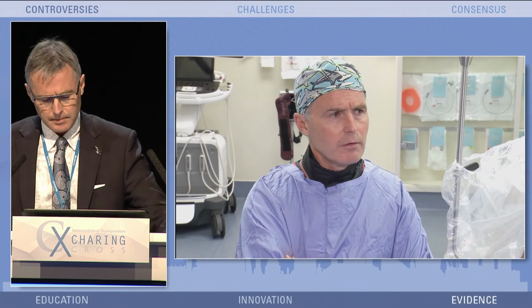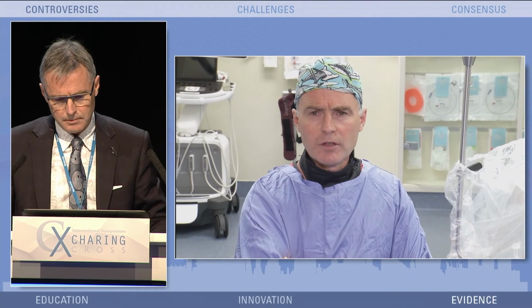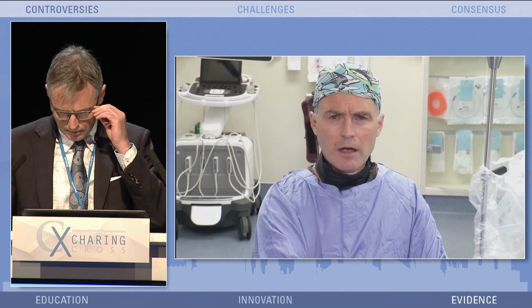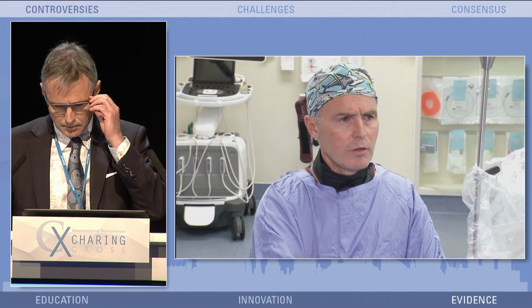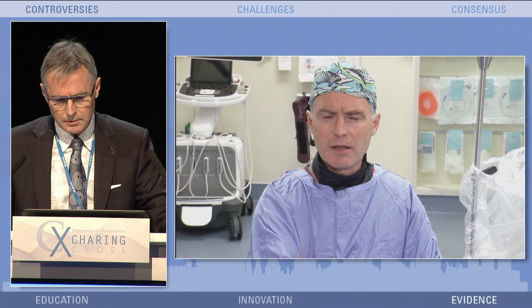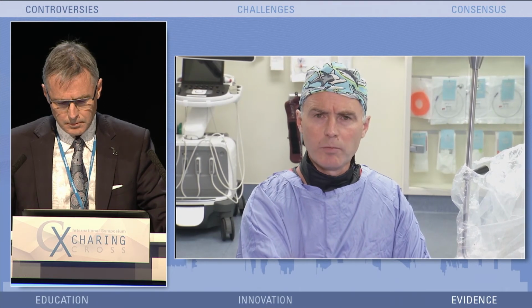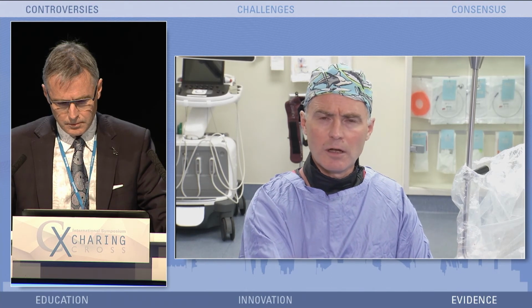All right, so this has been a very interesting case today and an interesting challenge for this patient. Has had bilateral critical limb ischemia and heavy calcification in both the femoropopliteal and tibial arteries as a consequence of chronic renal failure and diabetes. But with Shockwave lithotripsy, we've been able to treat the femoropopliteal segments and also follow that with drug-coated balloon angioplasty. On the right side, actually, the anterior tibial artery is providing good perfusion to the foot, and we didn't really find a tibial site that we can improve perfusion besides that.